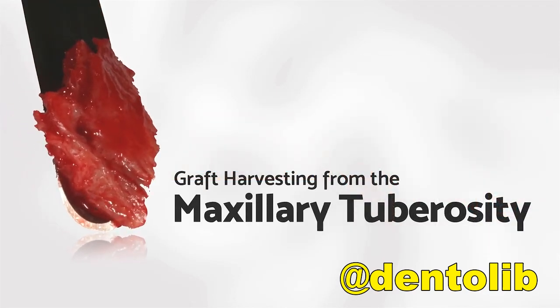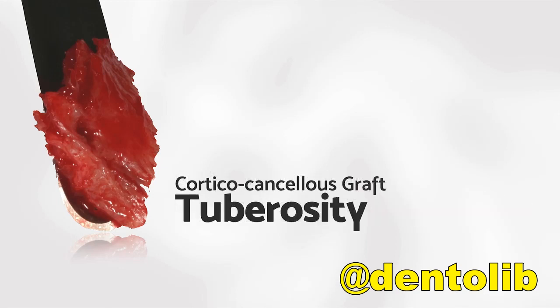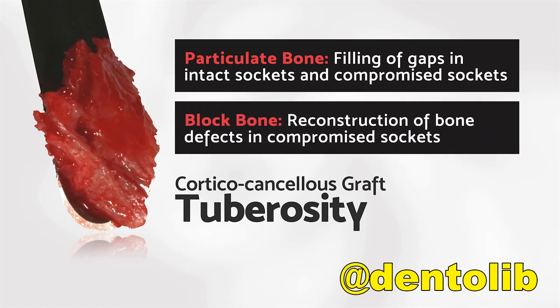Let's start talking about different types of graft to be harvested from the maxillary tuberosity. Let's start with the corticocancellous graft. Later on, I'm going to talk to you about how to take a triple graft from the maxillary tuberosity. The corticocancellous graft can be used as a particulate bone for filling the gaps in intact sockets and also in compromised sockets, and as a block bone for the reconstruction of bone defects in compromised sockets.